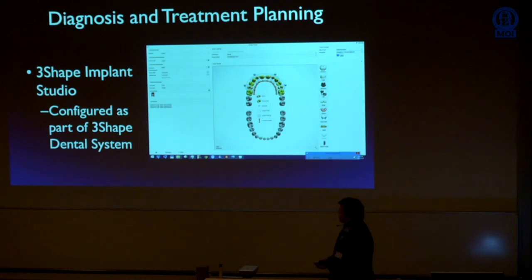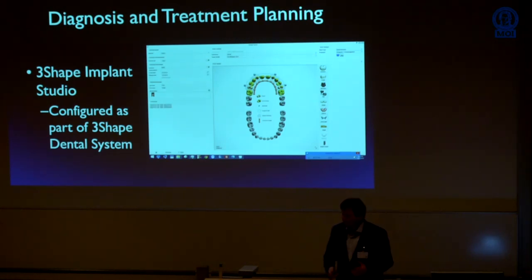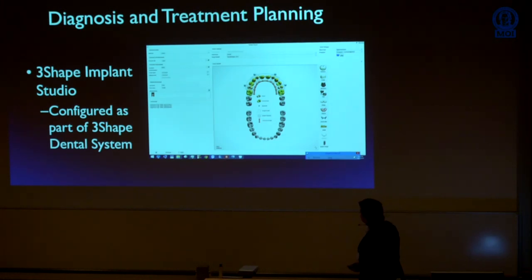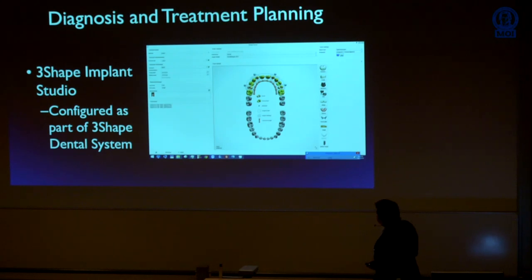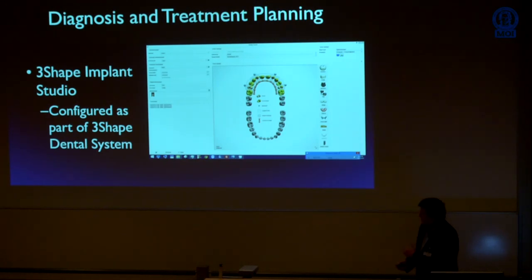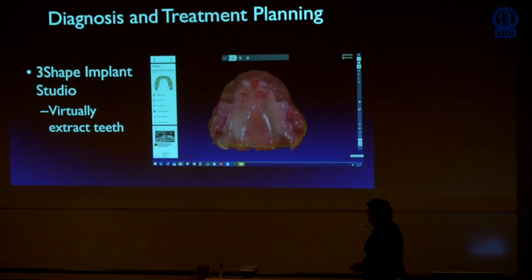We initiate the planning of the case in 3Shape Implant Studio. Now, this is something that clinics may not have, but labs may have. So if you choose to attempt this type of workflow, it would require the participation of a lab with the software. This is a case where we're looking at four implants. We set it up as we conventionally would with Implant Studio, assuming each of the implant teeth are abutment teeth, and we set up the remainder of the teeth as pontics. It's also important that 3Shape Implant Studio comes in a number of different versions. It has to be the version that's integrated with Dental System, with the rest of the software, because what you have to do in the next step is push the restorative design through the software. We virtually extract the teeth.